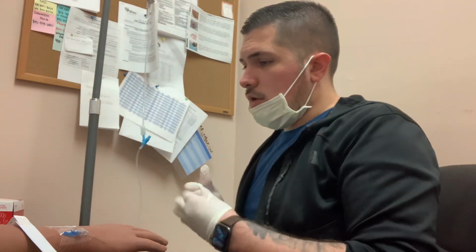So the IV fluids are flowing at 125 mLs per hour.